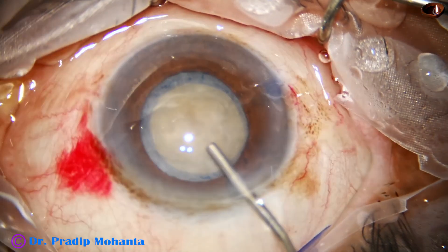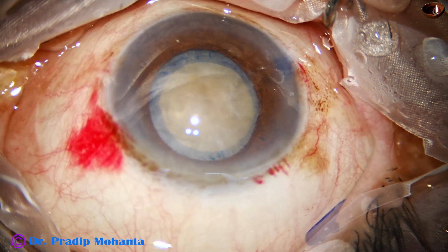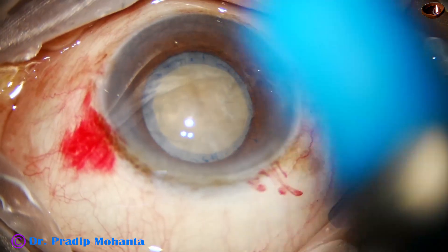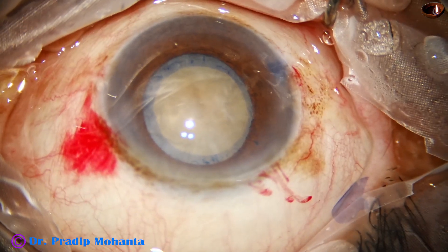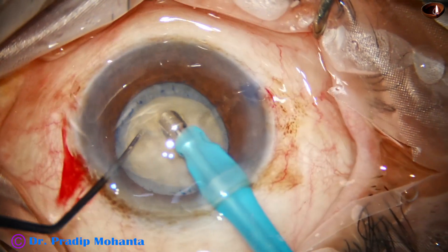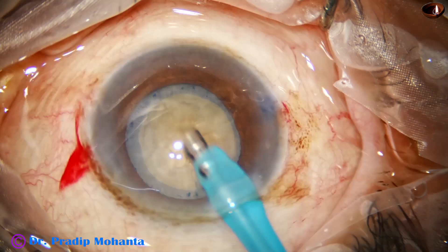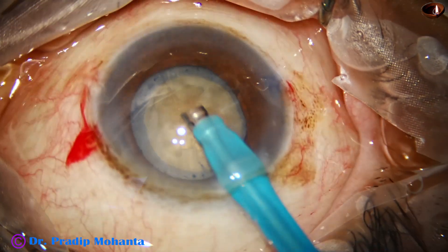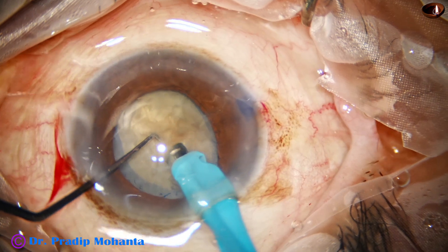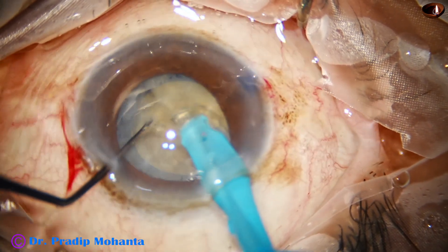A little bit of hydrodissection has been done because this rhexis was done on-the-go. Now the handpiece is introduced. The handpiece goes in with its bevel down and some superficial lens matter is removed. We see a very hard nucleus. The phaco needle was introduced bevel down and now the handpiece has been turned to make the bevel up, and the tip goes inside the substance of the nucleus.